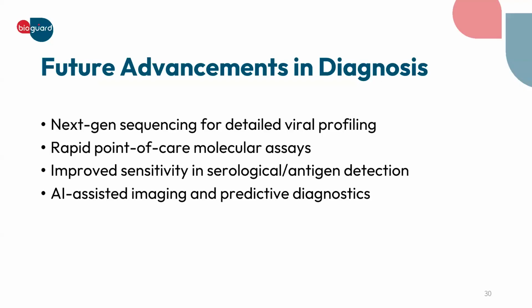So next generation sequencing can target the mutations that are occurring in FCoV, which are related to FIP, which cause FCoV to become FIP. So it confirms those mutation sites, which can then be easily diagnosed through PCR or through other methods, as well as rapid point of care molecular assays that are day by day getting easier to use and can be performed in the clinic.